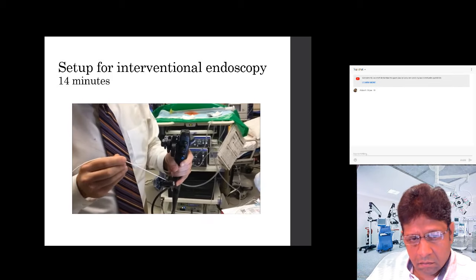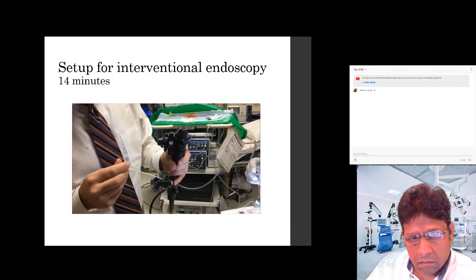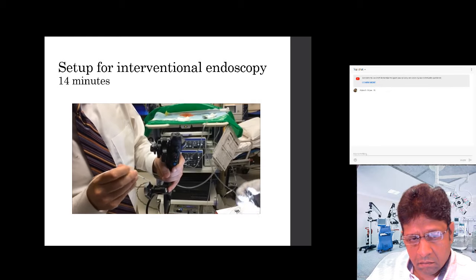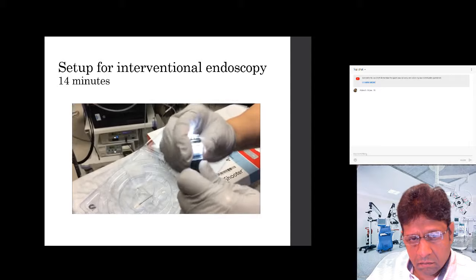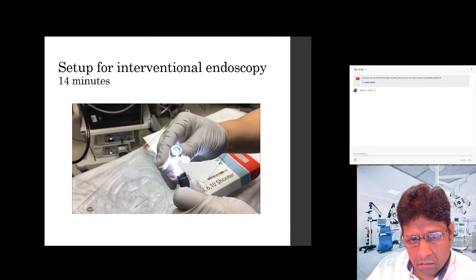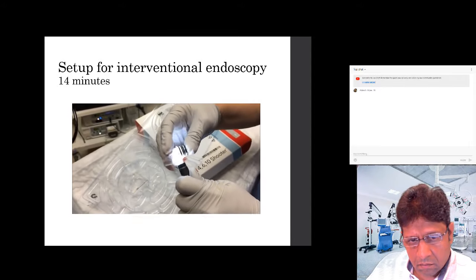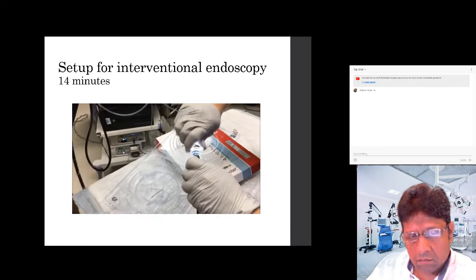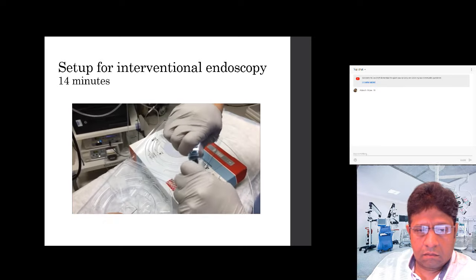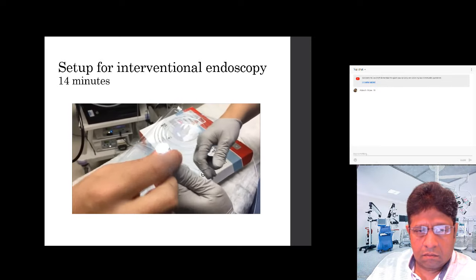And here comes the actual bander. Let's see. Okay, and then that just fits on the top. Okay? Hold on, yep. And then we take this off. Now we don't need this anymore. We've loaded. I'm going to put that off to the side here. You screw that on, or it just... You just kind of push it on. You don't have to go too tight.